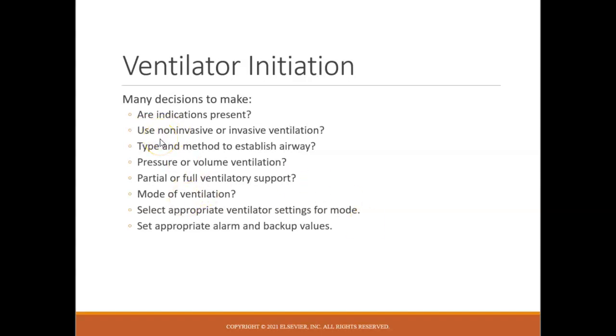I want to look at my options on whether I want to use non-invasive or invasive ventilation. So non-invasive meaning, is this patient a good candidate for BiPAP? You learn in your disease class, I think they talk about this a lot when they're talking about the different disease states, which diseases are more appropriate to try to make BiPAP work for, which really comes down to your COPD patients. And then when we get to neonatal patients, all of your neonatal patients pretty much. But when it comes to your ARDS patients, your asthmatic patients, there's not a lot of data to show that there's a benefit of doing a BiPAP trial. So those patients, you'd be more apt to just go, let's just intubate and be done.